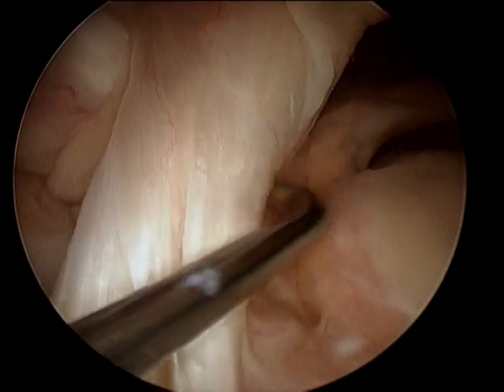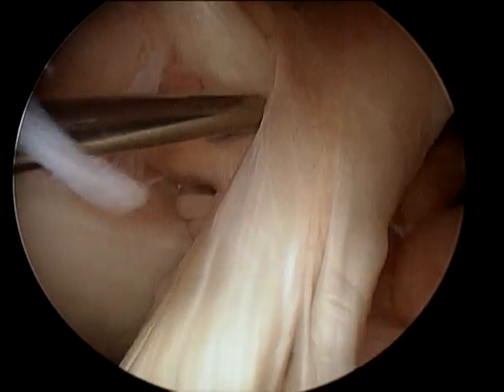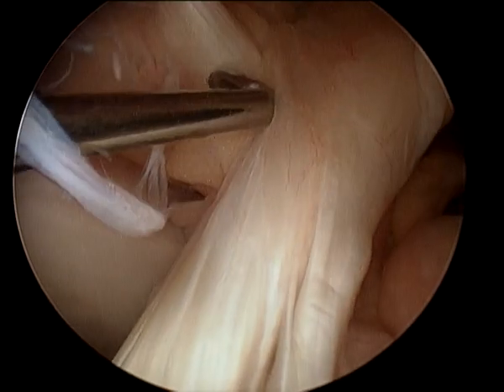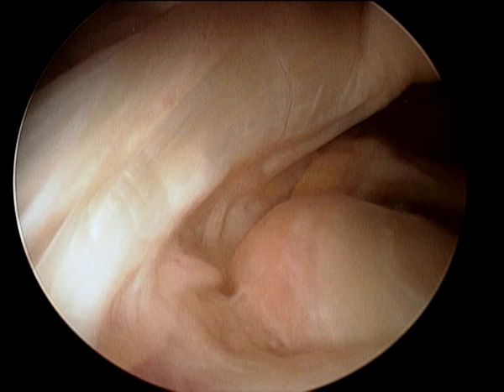That there is the anterior cruciate ligament. And behind it, crossing — you don't often see it that well — is the posterior cruciate ligament there at the back, which all looks fine. The kneecap region also looks fine.